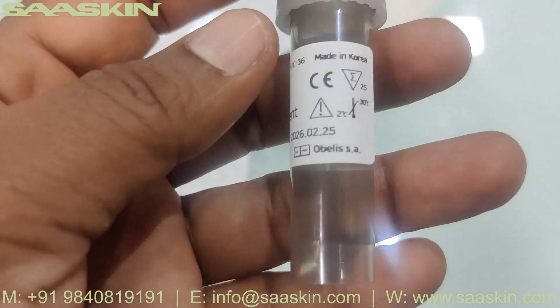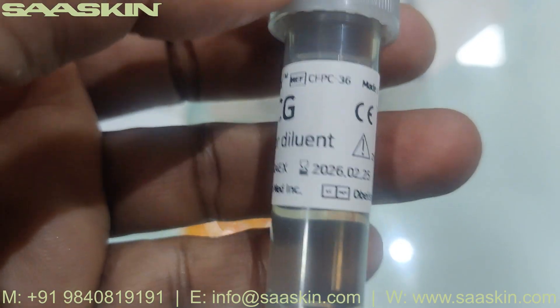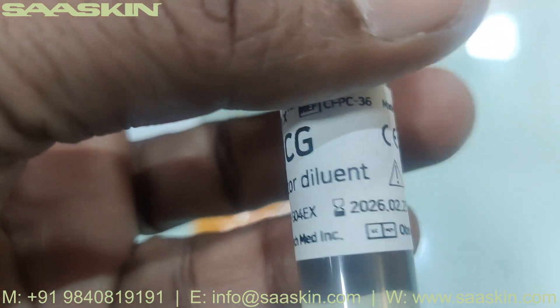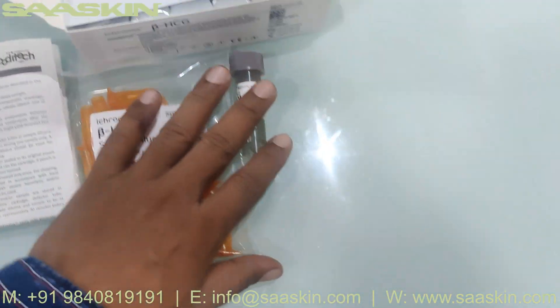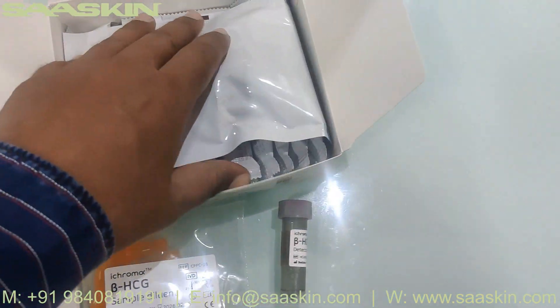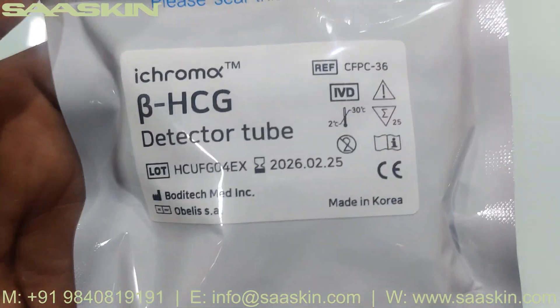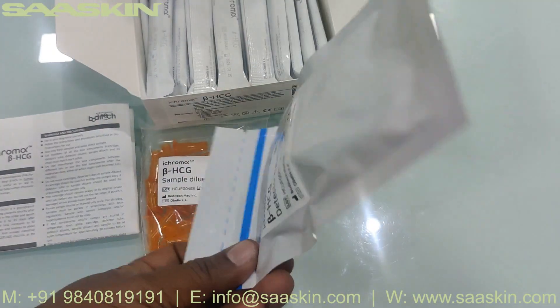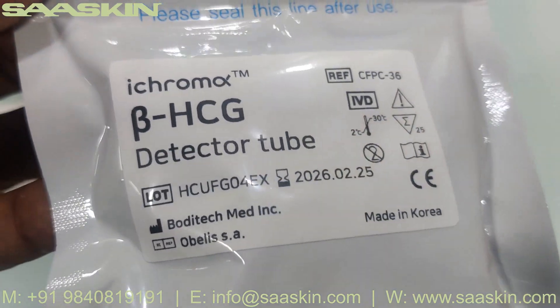Then there is one Beta HCG detector diluent — the bottle is here. This also has the lot number and expiry date. And then there is one pouch which has the Beta HCG detector tubes, 25 pieces. In this pouch you have 25 pieces, and you can see the lot number and expiry date is given here.